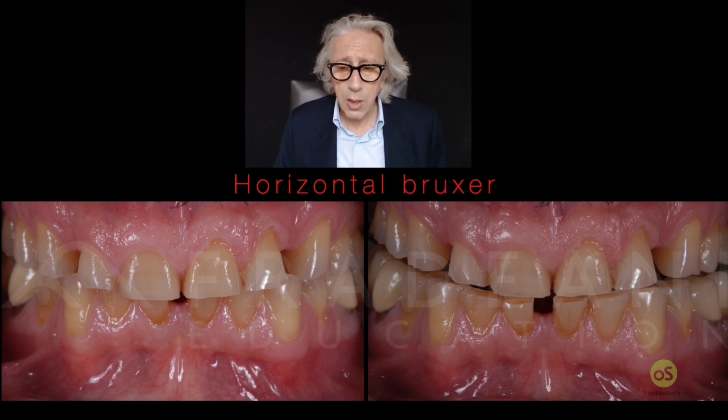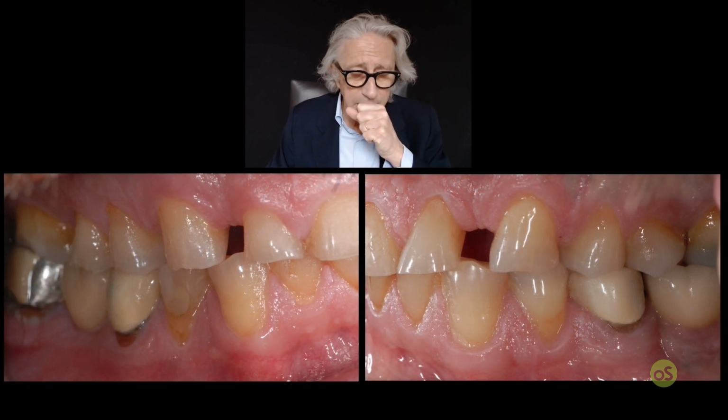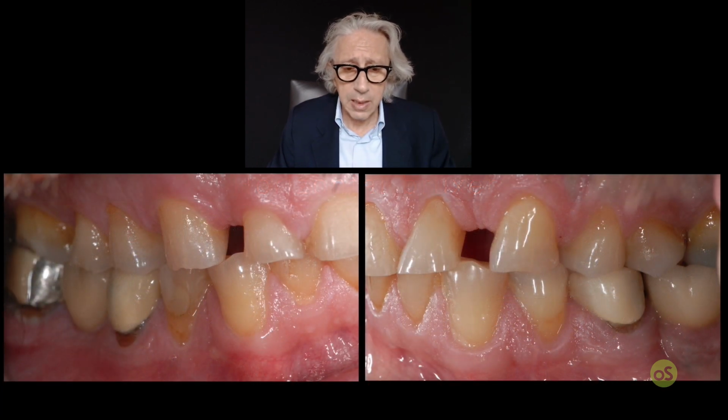So now, if you want to treat the case completely in CR, of course, you need to increase the VDO, because you have to highlight the new length of the teeth, since they have completely disappeared. As you have seen in the previous slides, we have no possibility to see any teeth at all. Another problem is the position of the cuspid and the lateral. We should understand if it's possible to do something in the proper way.